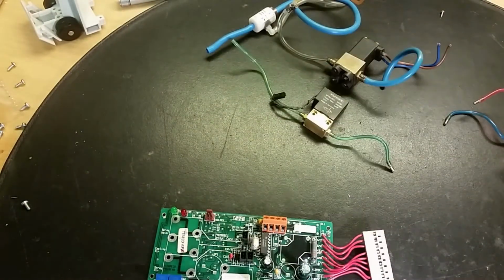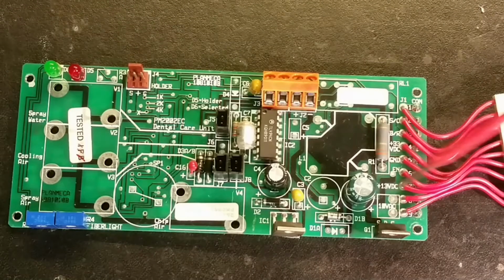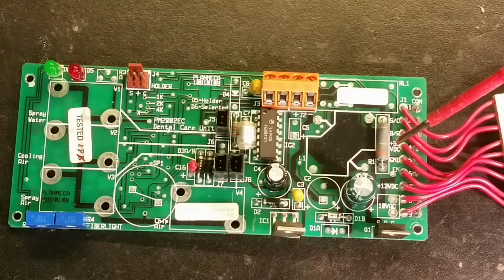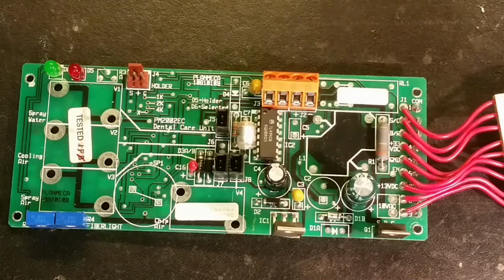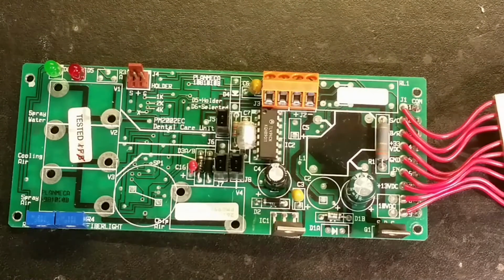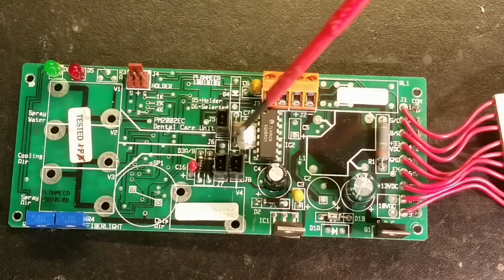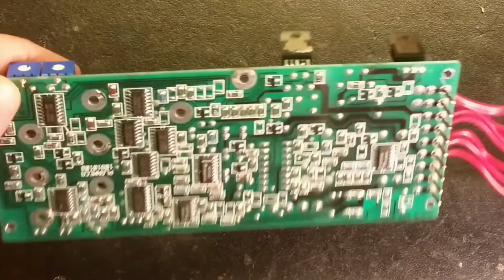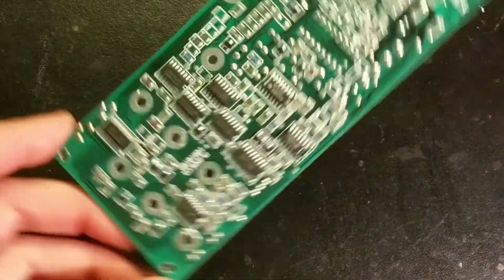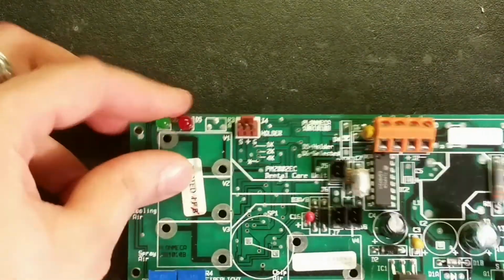Let's have a closer look at the circuit board. So on the circuit board there's not so much on it. With the regulator here, a transistor or a MOSFET, 10 volt AC, plus 13 volts, ground, plus 33 volts DC, that's a lot, and some control wires here, and one here. Some shipped. These 2 were going into this nozzle. These 2 thin wires were connected here. Eventually that goes to a switch that turns this unit on. The micro switch was here. These are 2 terminals for the valves, and the large valve was connected here. And on the back side were these logic gates, CMOS gates. Got 2 trimmers, 2 LEDs.